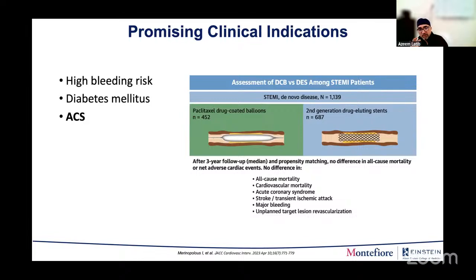But I think if I did a high bleeding risk patient, and I'm really worried they're going to either bleed on me or they're going to need surgery before months over, I like this technology rather than putting another stent in. I feel much safer if 2 weeks after the procedure I had to stop everything and I just did a balloon versus putting in a bare metal stent. Oh, well, we don't have bare metal stents, a drug-eluting stent, because we don't keep bare metal stents anymore.